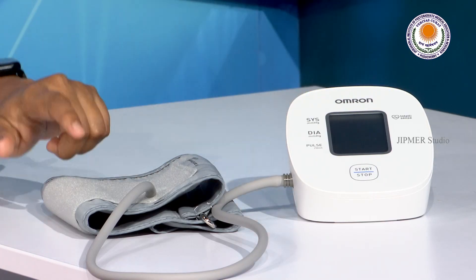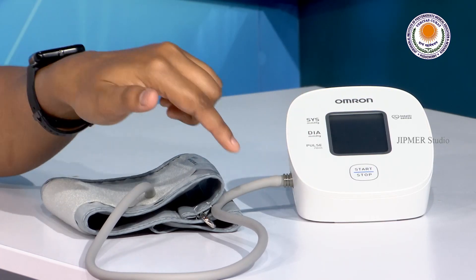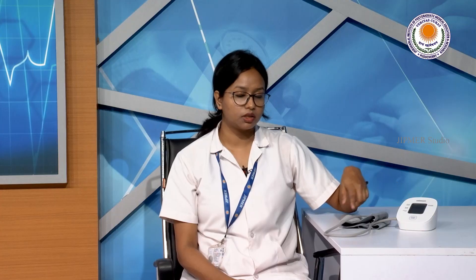This is an automated blood pressure monitor. This is the main machine, this is the cuff attached to it, and this is the connector hose between the machine and the cuff.